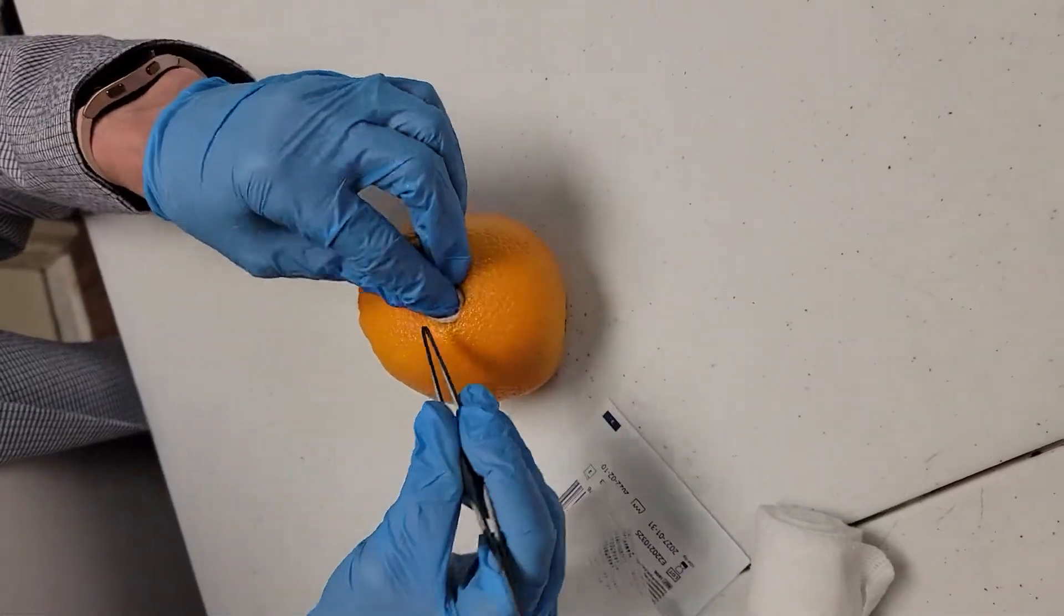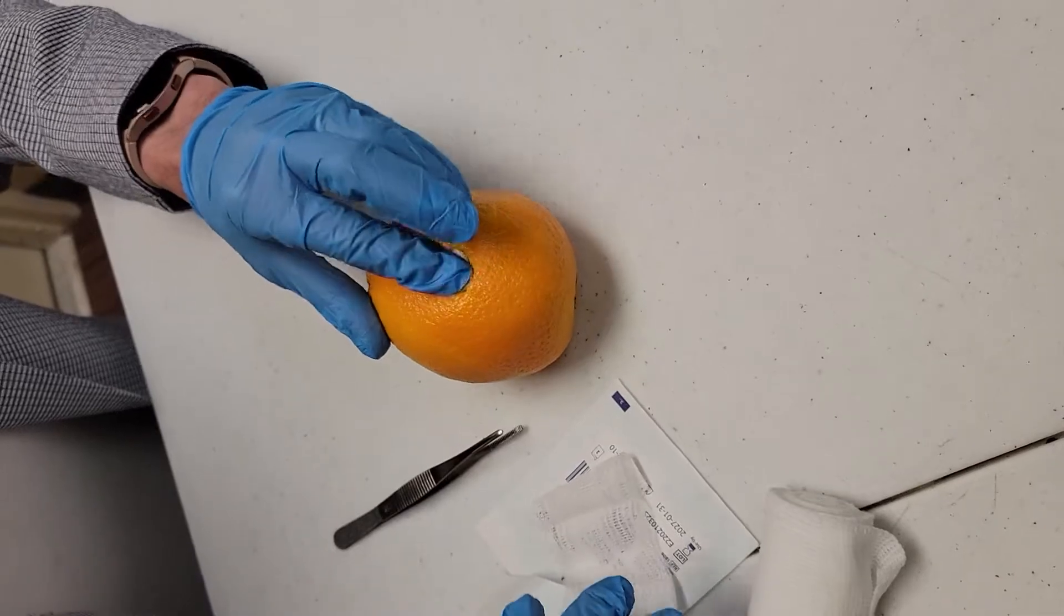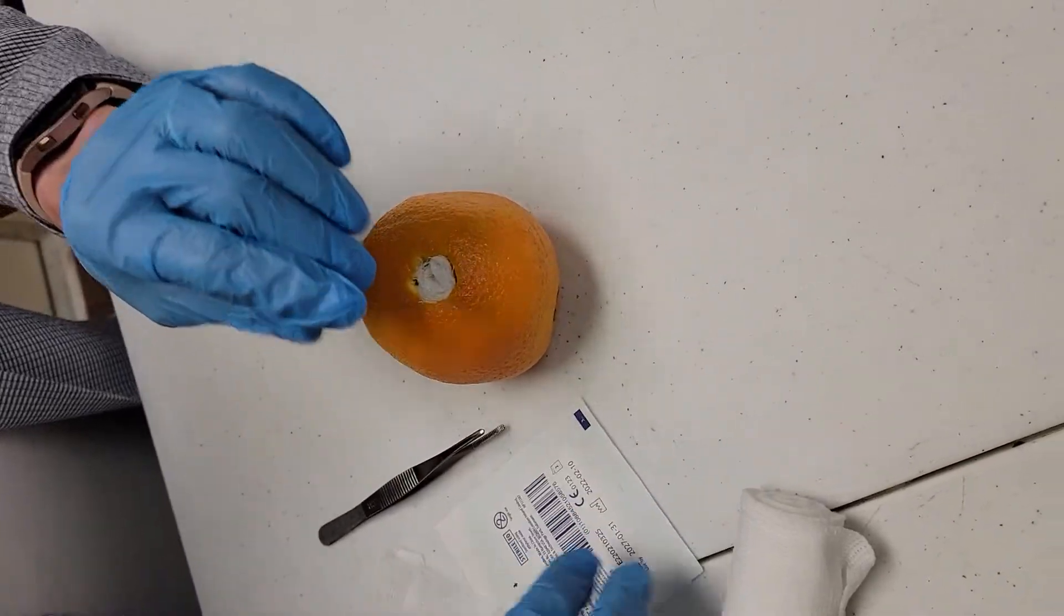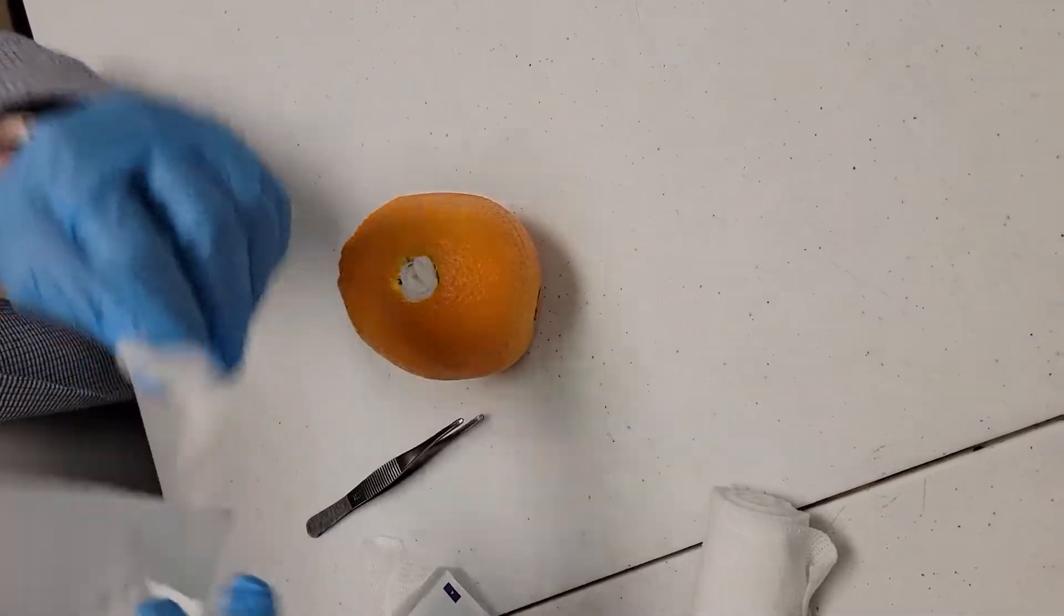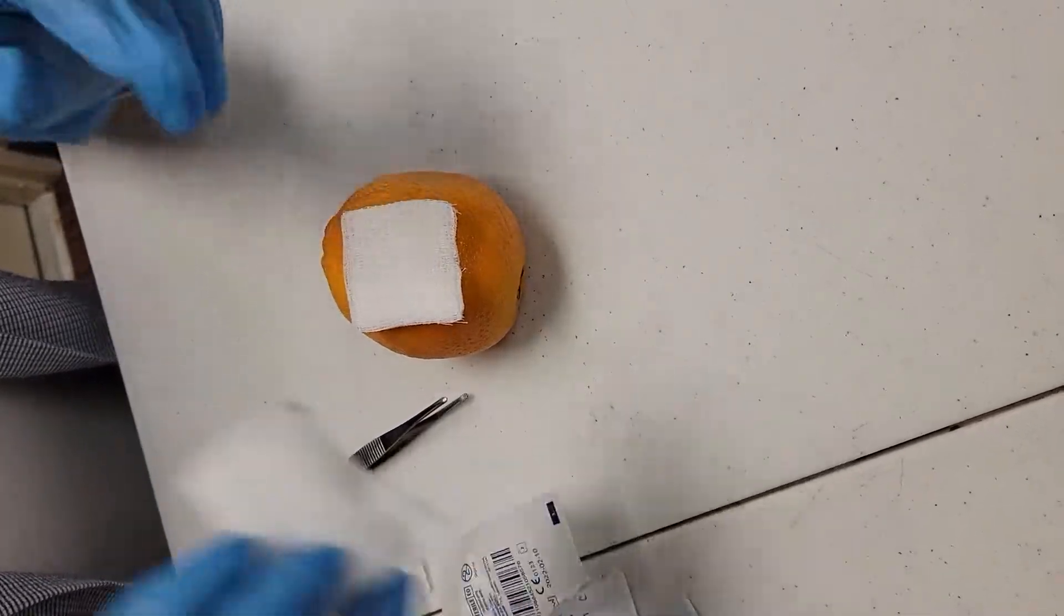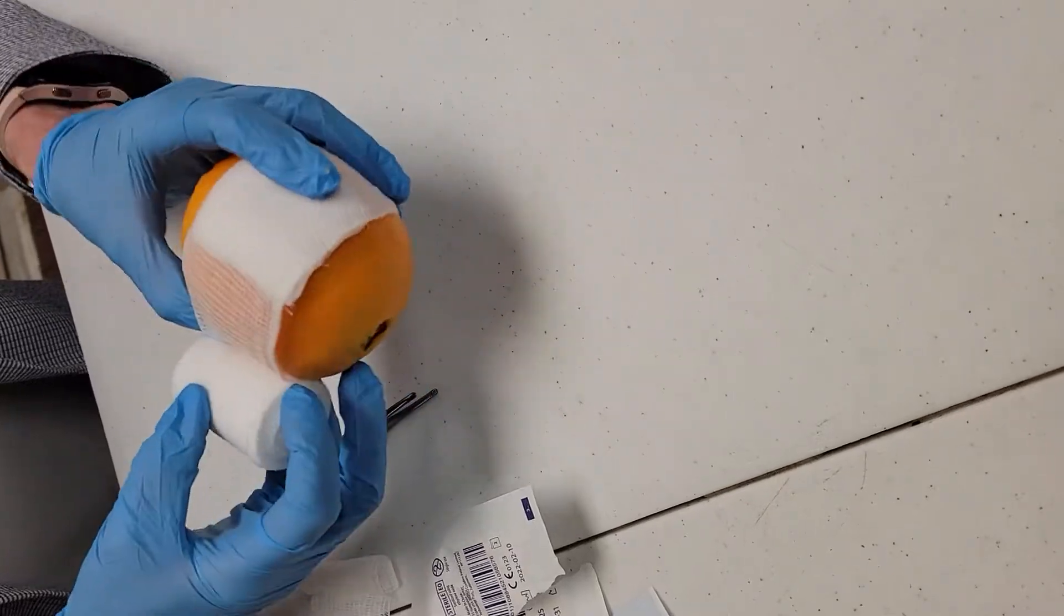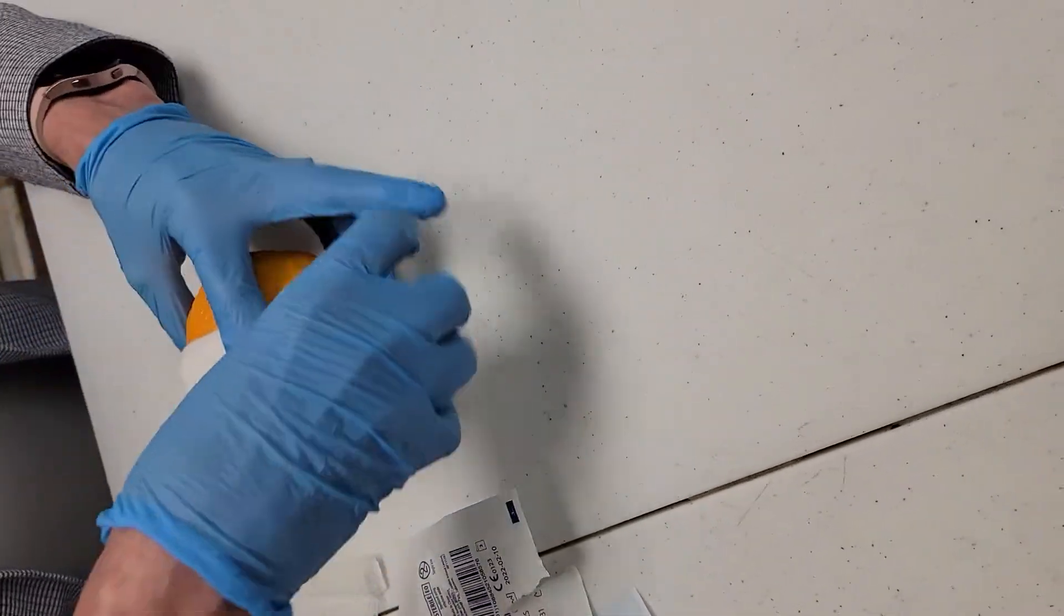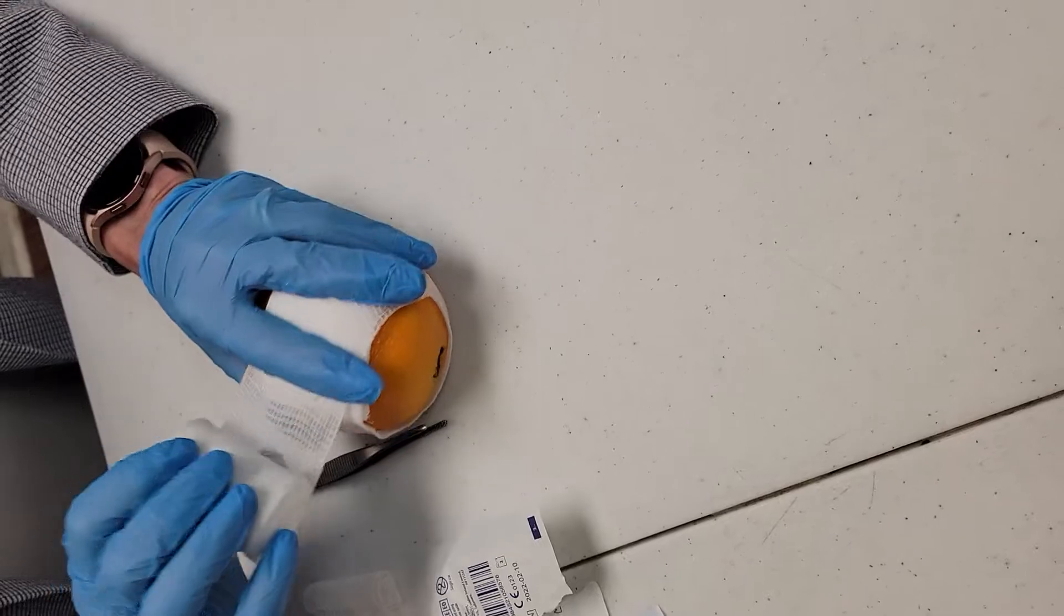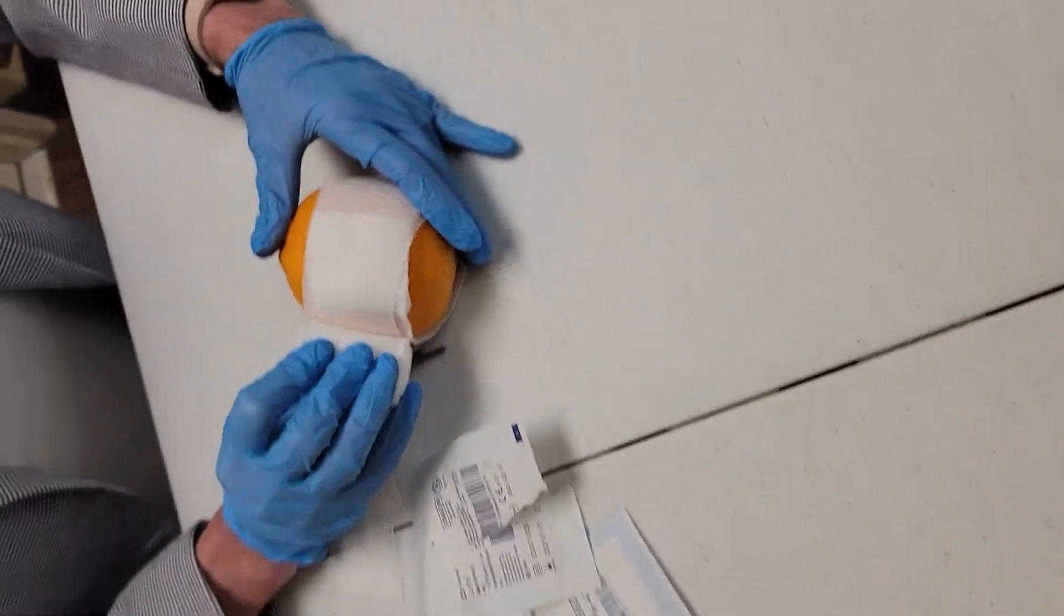And then what we'll do, assuming that's all filled up, take your other sterile gauze, pop it on top. And then you would wrap it, wrap the wound with the non-sterile gauze. So sterile then non-sterile. And then you'd cut it off and tape it up. That's it.